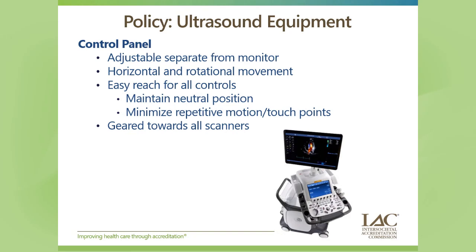important. And so thinking about that, especially if your vendors are good about asking for feedback about their systems, being able to maintain that neutral position so you're not having to move your hand very far with the one that's working the control panel. And as I mentioned earlier, it's not as much reach if there's abilities to maybe move some from the central portion of the control panel up to that touchscreen, or ensuring that the touchscreen isn't that far away from you. But it should be geared towards all scanners.